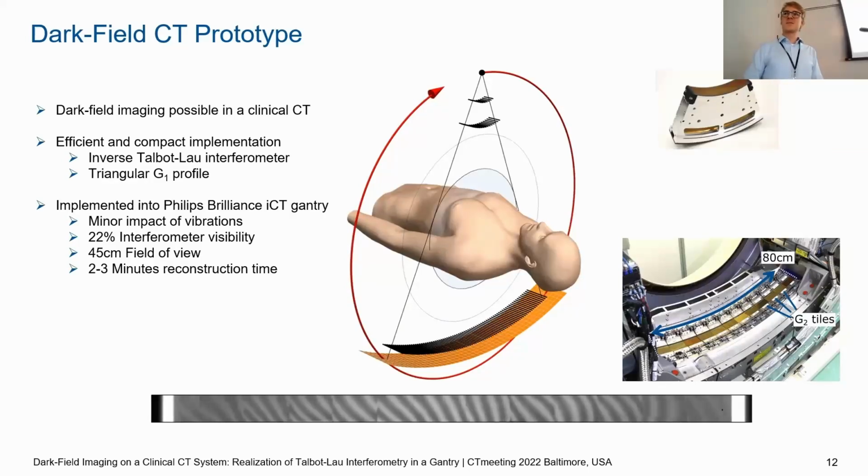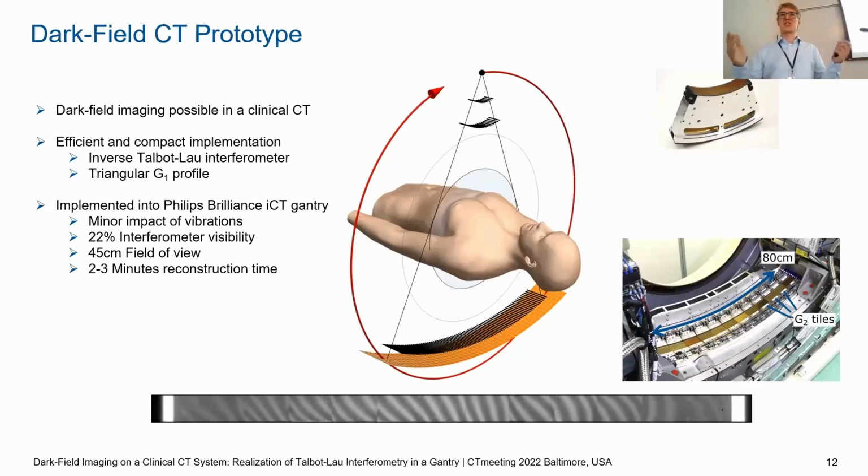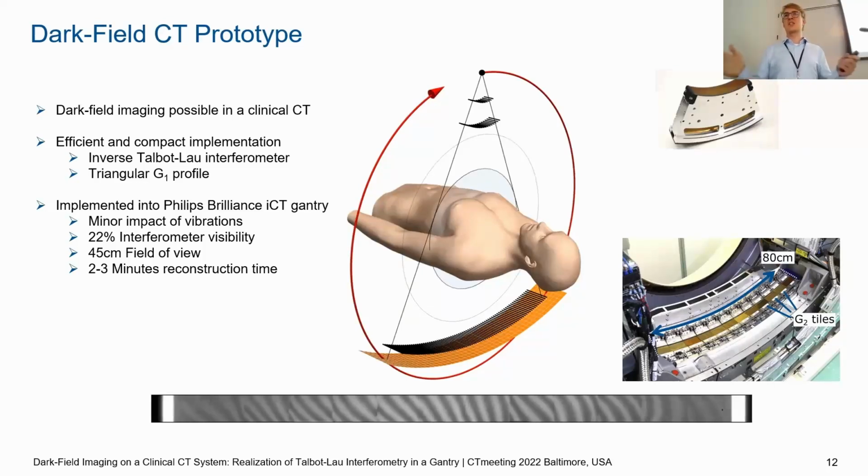Thanks for the nice presentation. You didn't explain why the visibility is lower at the edges of the detector. Oh yes, I probably skipped this. There are two issues arising there. We have shadowing in these high aspect ratio grating structures, and in these outer regions, for these larger fan angles, we have an extremely large apparent source spot, and so the shadowing increases.